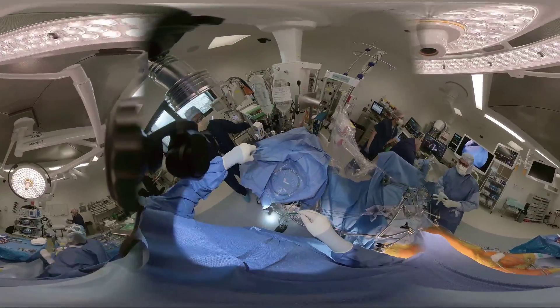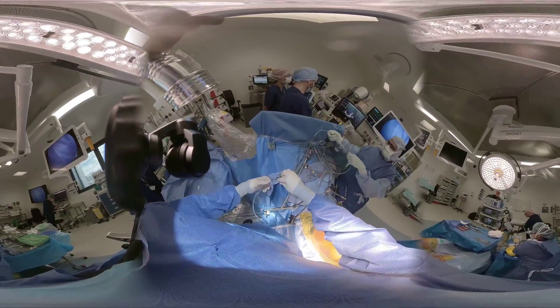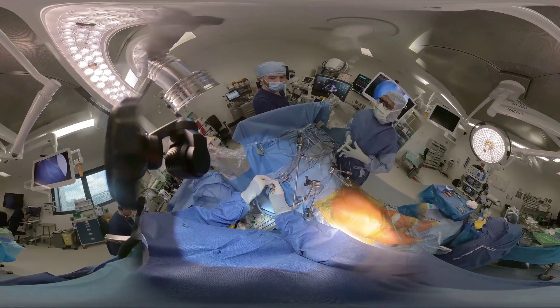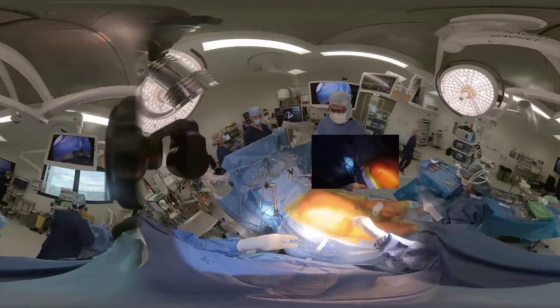Two defibrillator pads are placed across the chest wall. The patient is positioned supine with the right chest elevated by a small pillow beneath the right scapula, and the right arm is placed on a sideboard to maximize space for placement of the surgical ports.